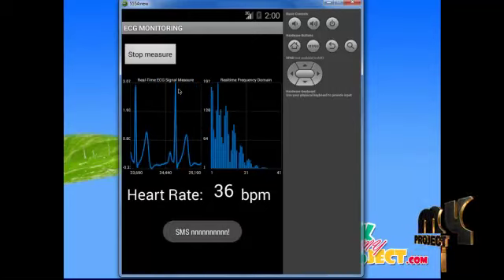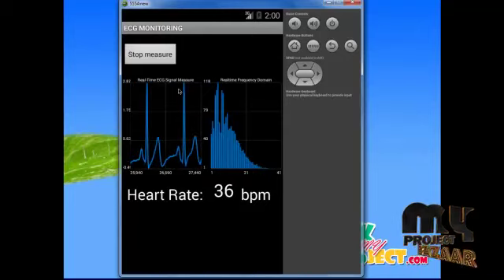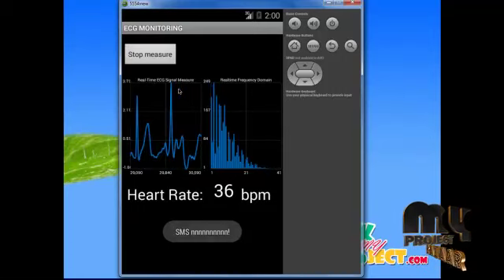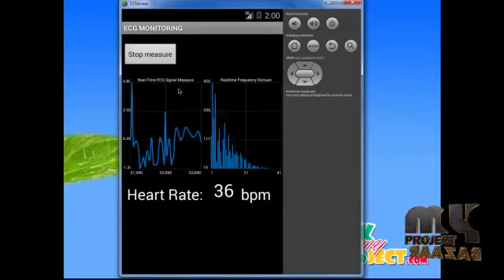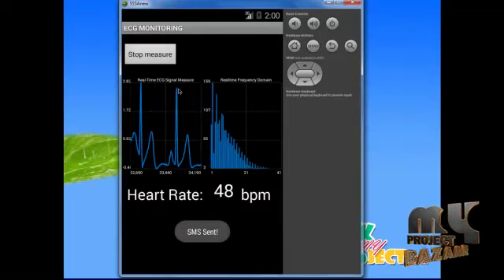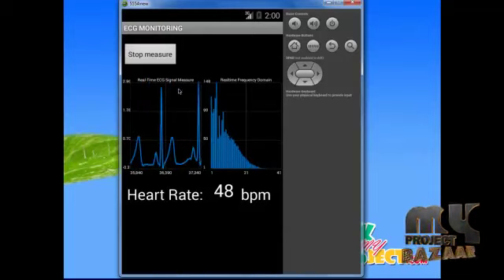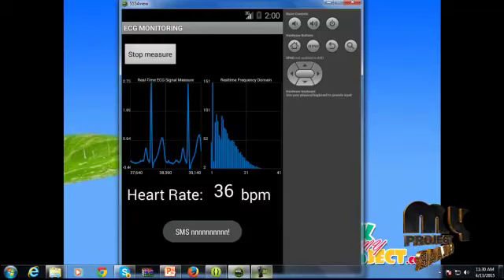So we will analyze the ECG wave by counting the spikes in each cycle of the ECG wave. The highest spike value is calculated and compared with the threshold values. If it is not within the threshold, an alert is generated. After that, the smartphone reads output received from the dataset module and displays it on the screen. The ECG packet will be decoded and plotted using Java. After plotting, if the value is critical, an SMS will be automatically sent to the doctors.